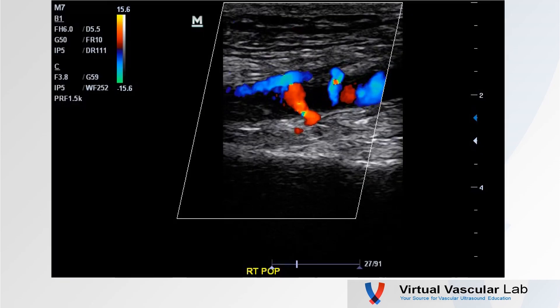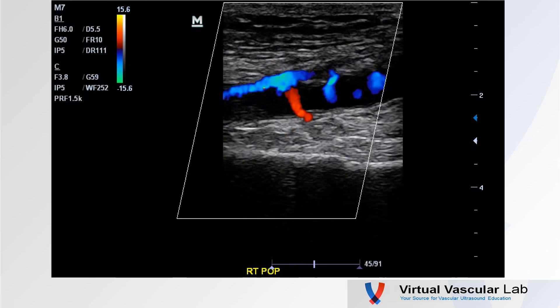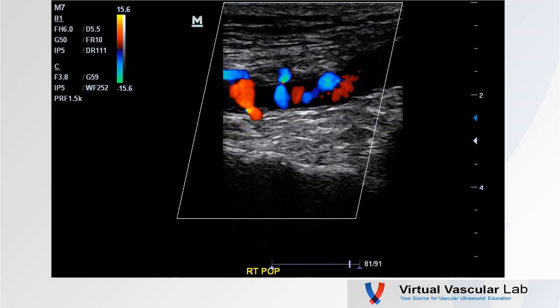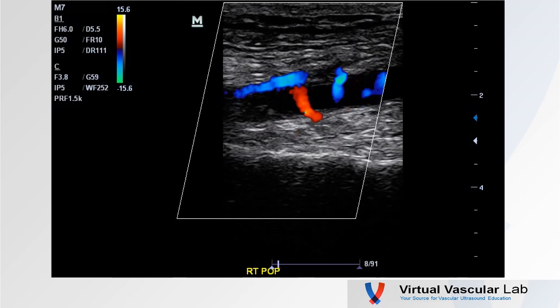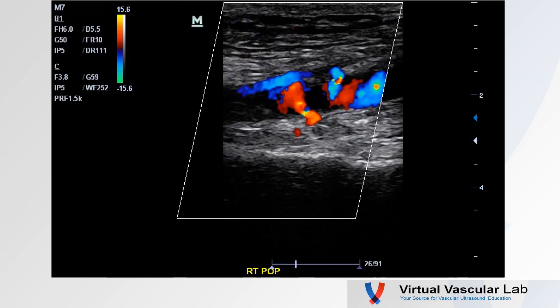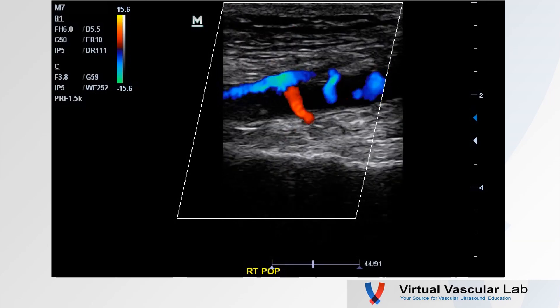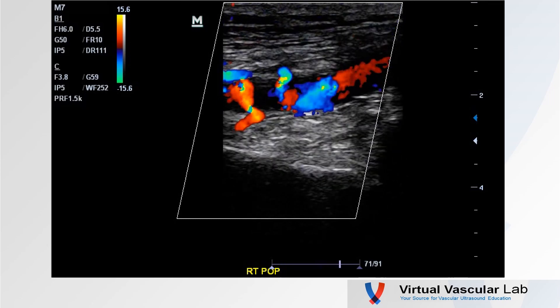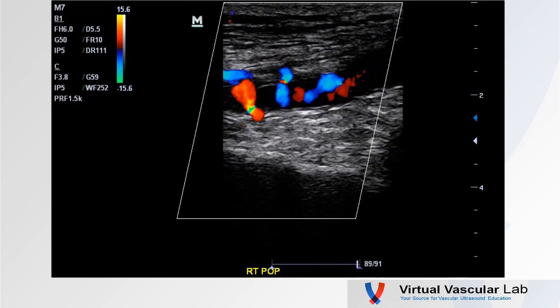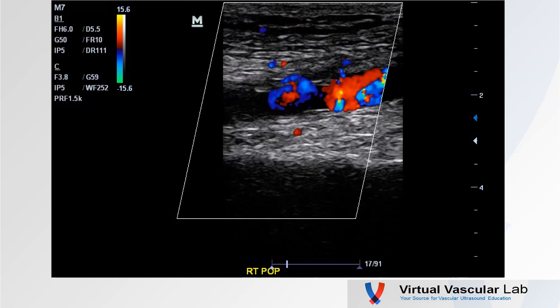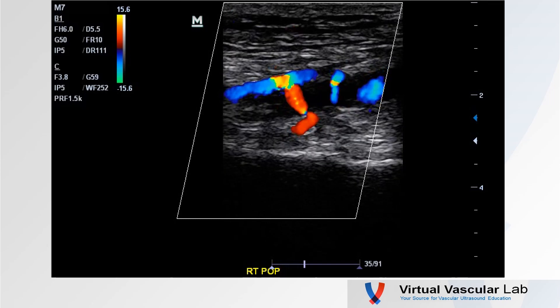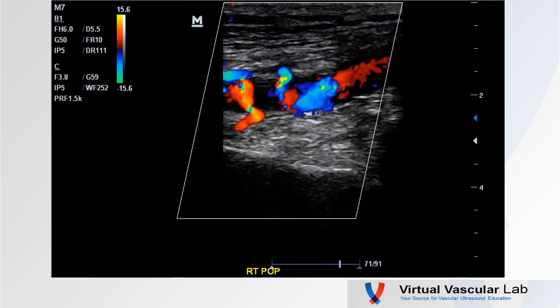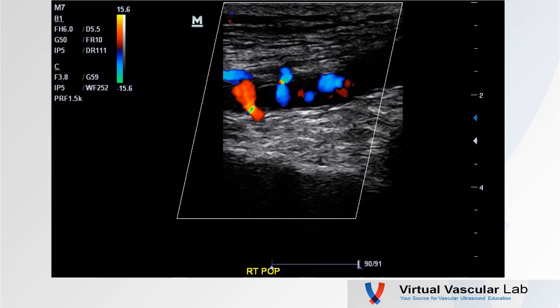These are pretty cool to look at in real time. Here's a popliteal artery — note we have a couple of branches. There's a collateral off the bottom: flow towards is red, going into the popliteal artery — an inflow collateral. Another one in blue at the top: flow away from the transducer is blue, so that's a second inflow collateral. Definitely abnormal.